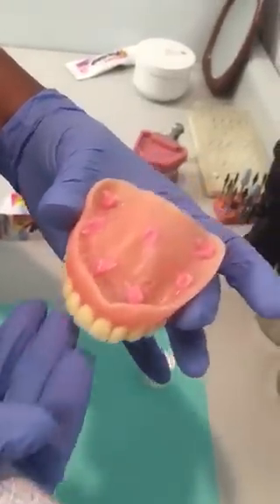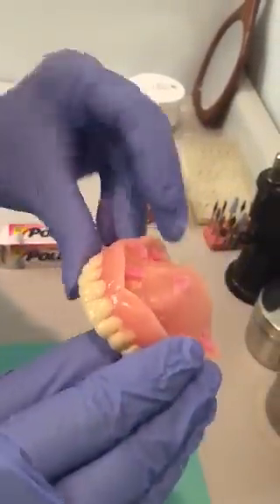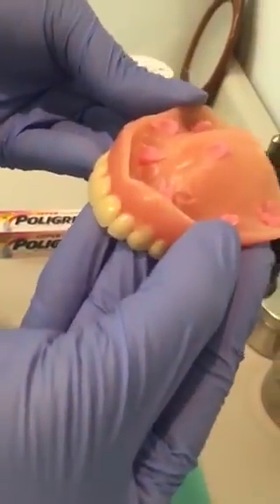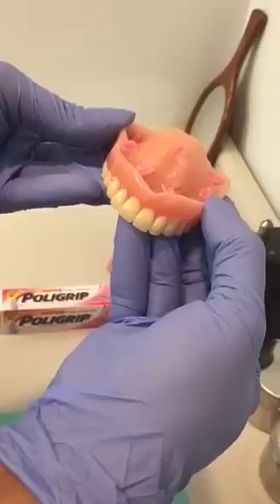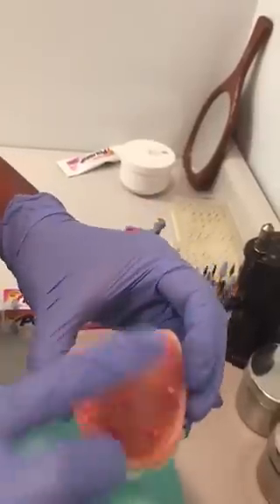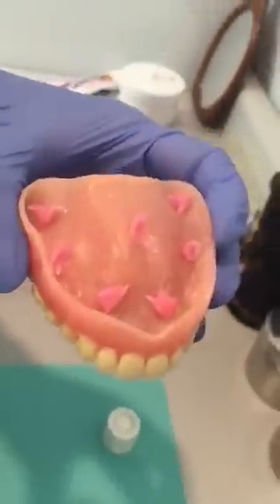You place the denture into the patient's mouth and use your thumb and forefinger to hold it in place for about a minute, then release. You also need to make sure that the surface area of the denture is very dry before you do the application.